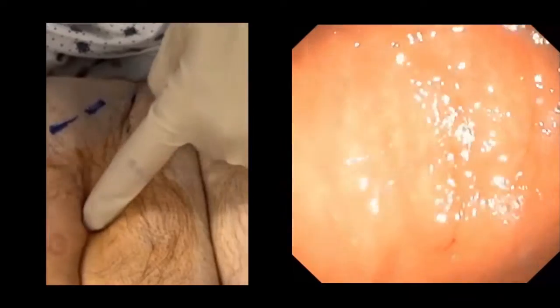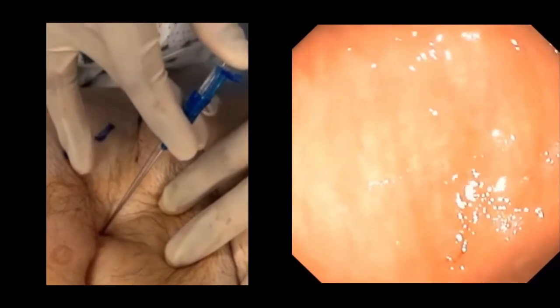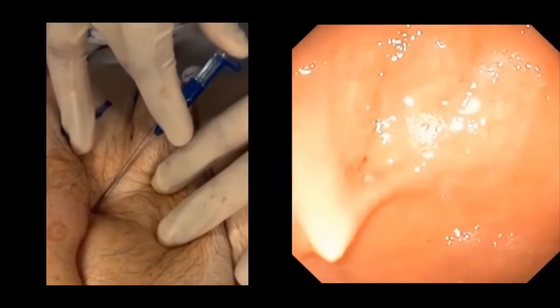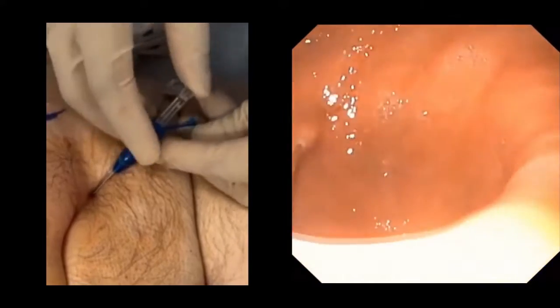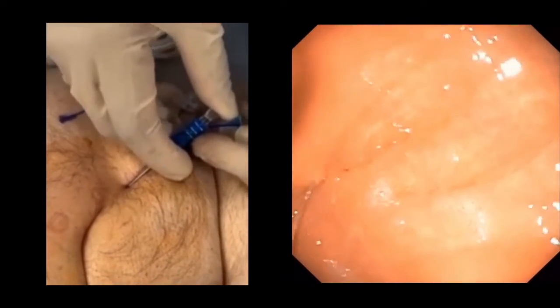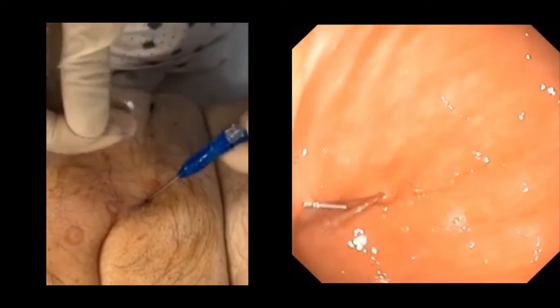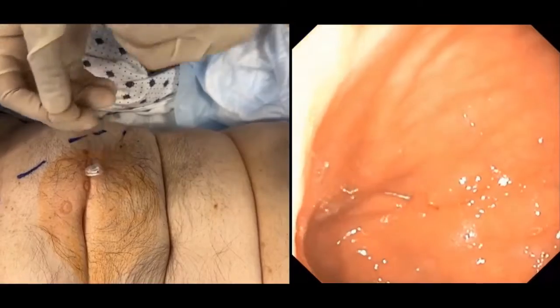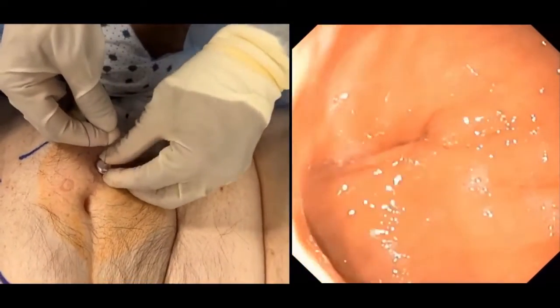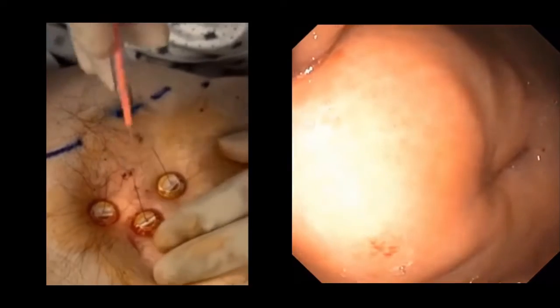Back to the patient, we will be using three T-fasteners in the same way illustrated previously to approximate and keep the stomach wall fixed to the abdominal wall during the procedure. Here you can see the first T-fastener entering the stomach. We deploy the first T-fastener to pull the stomach wall closer to the anterior abdominal wall. The three T-fasteners are inserted in a triangle pattern encircling the tube insertion site.